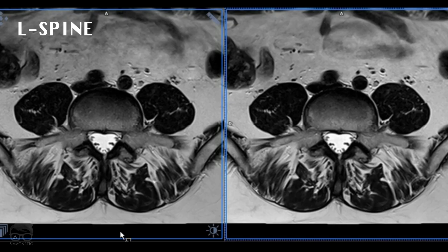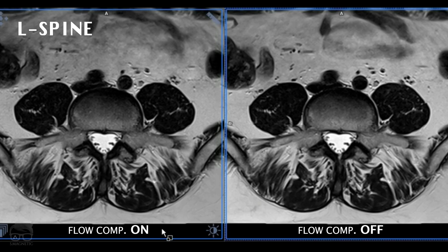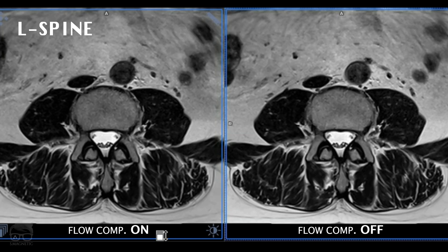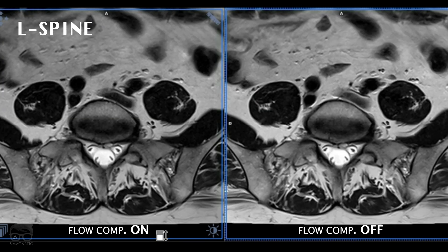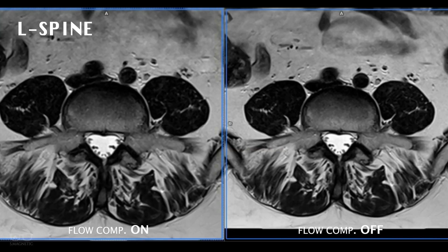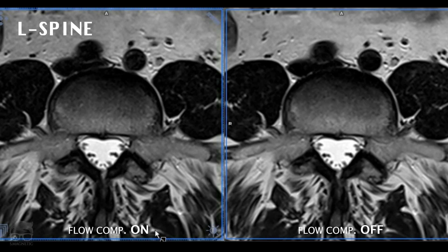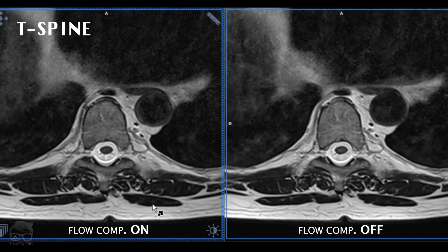Let's compare these images — we are now in view mode. What you see here is the first image for the L-spine: the first is flow compensation slice on, and the second is off. At first sight, it looks particularly the same — I don't see any huge difference. For the L-spine, I'm pretty sure that you can turn off the flow compensation.